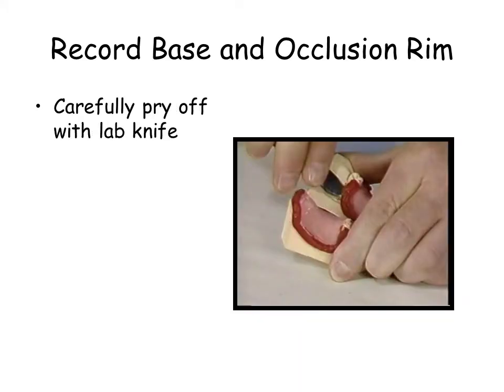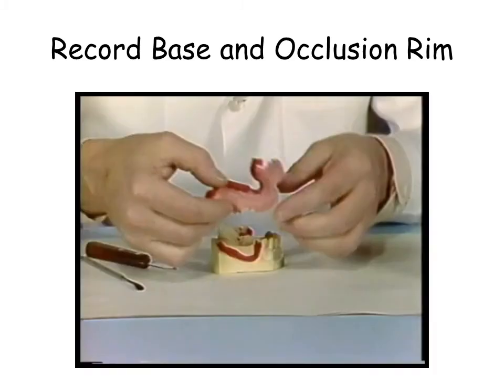When the polymer is sufficiently cured, gently remove with a laboratory knife. Remove gross flash with an acrylic burr.